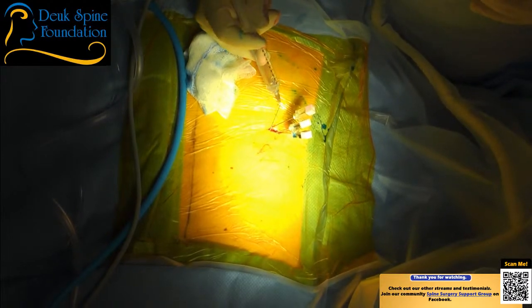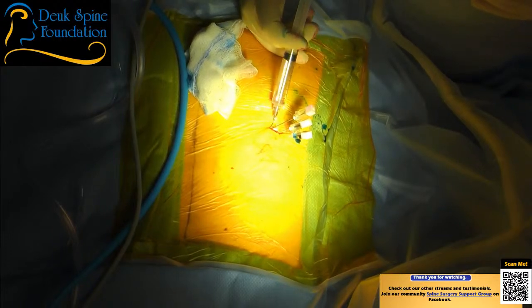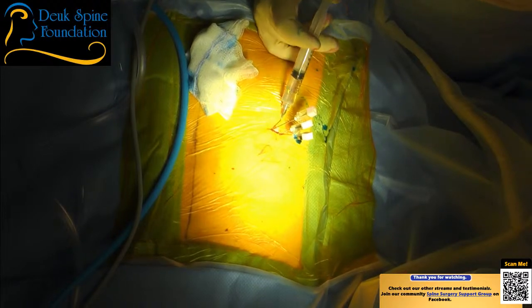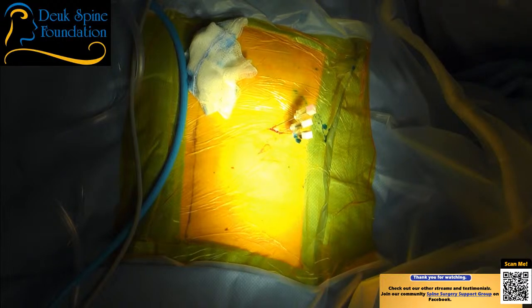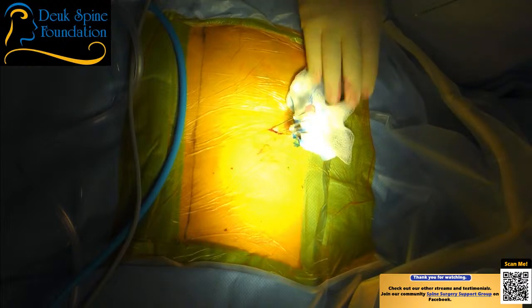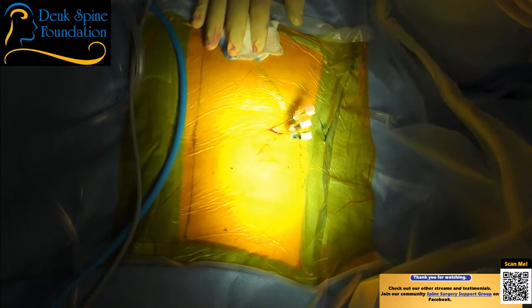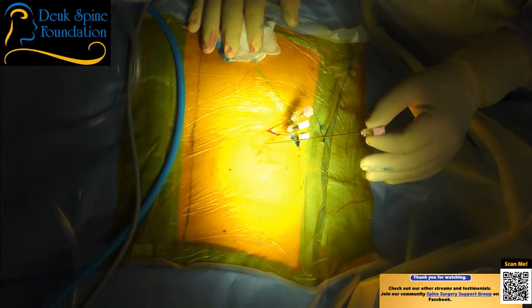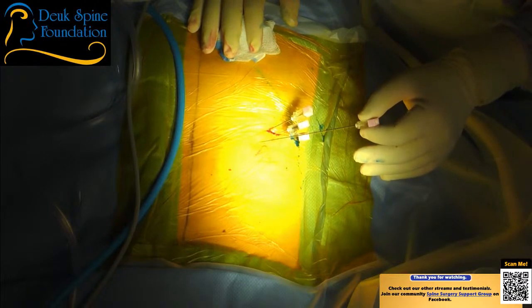Are you comfortable? I want to try one more thing. I want to try a different angle for 3-4, see if I just can't get it in. Just a few more minutes and we're going to put you to sleep. There's a needle down here. So I probably could get 3-4 with what I've got once she's asleep. But I want to just try coming in at a little bit higher point and just see if I can access that space.